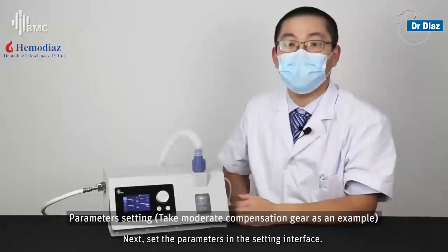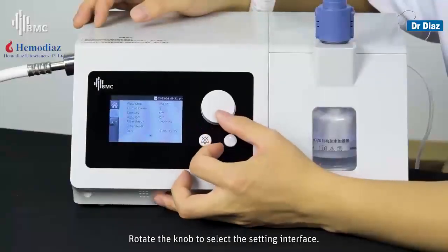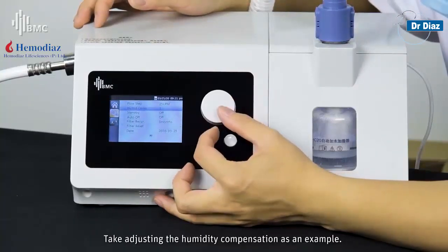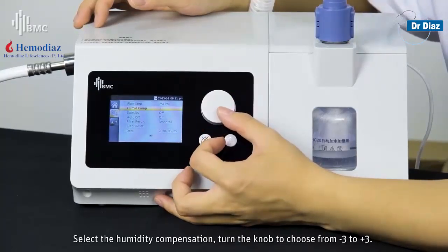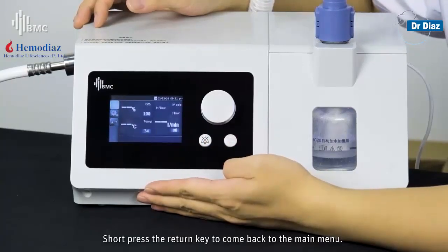Next, set the parameters in the target settings interface. Rotate the knob to select the target settings interface. Taking adjusting the humidity compensation as an example: select humidity compensation, then turn the knob to choose a value from minus 3 to 3. Short-press the return key to come back to the main menu.